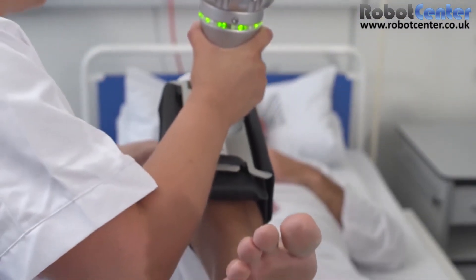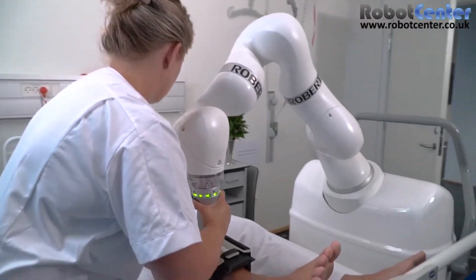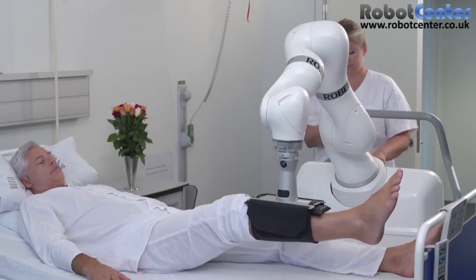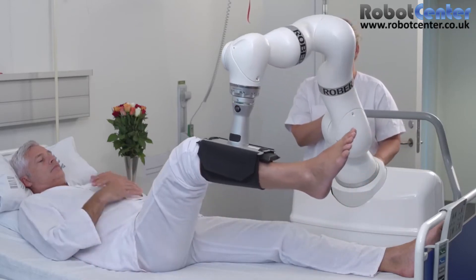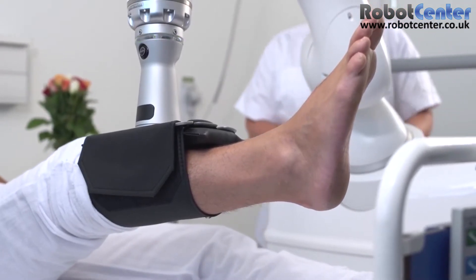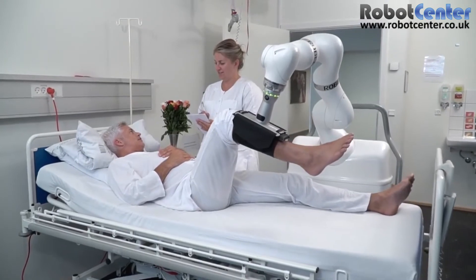The extent of Robert's pattern of movement is not limited to a set of predefined exercises or directions of movement. When the therapist has demonstrated the exercise, she will press play and Robert, having copied the exercise, will repeat the movement a suitable number of times. It is possible to pause the exercise should the patient need a break.